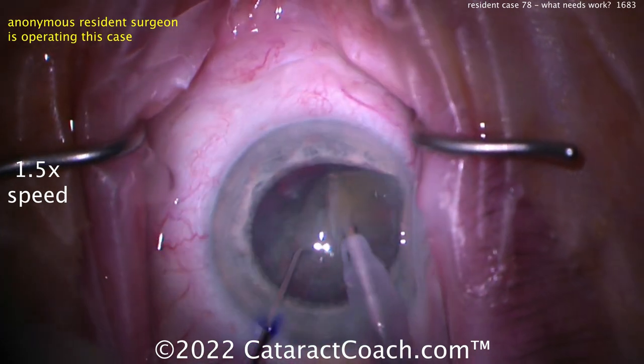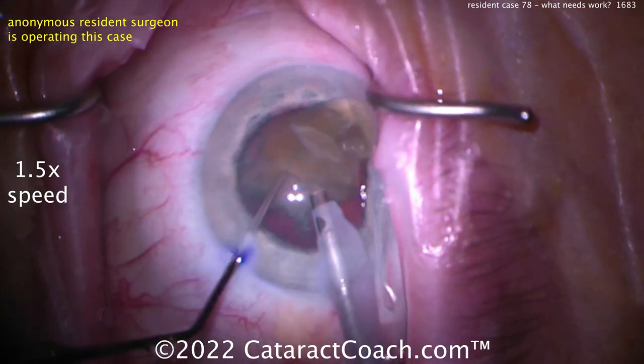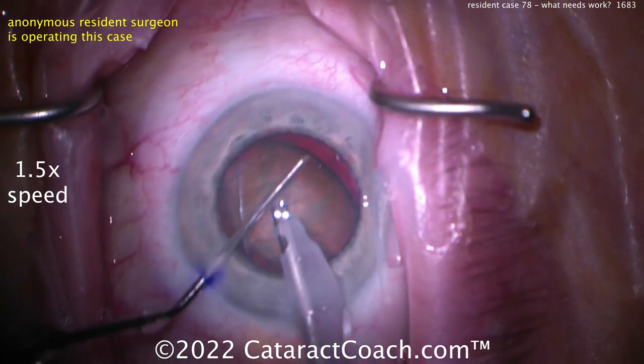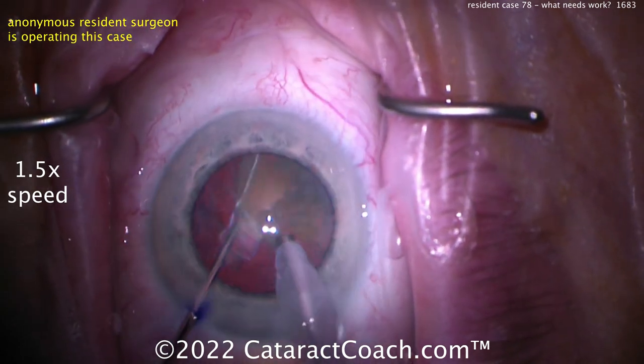You're totally anonymous, so you're not getting any credit here publicly — but if you hadn't said case 78, I would probably guess more like case 200. So you're doing great, far ahead of the curve. Now what do you do with this big piece? Bring it — don't go to the edge of it, that's better.